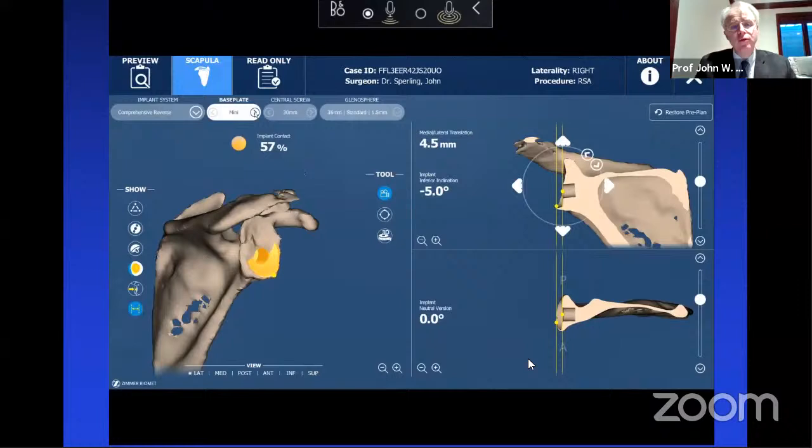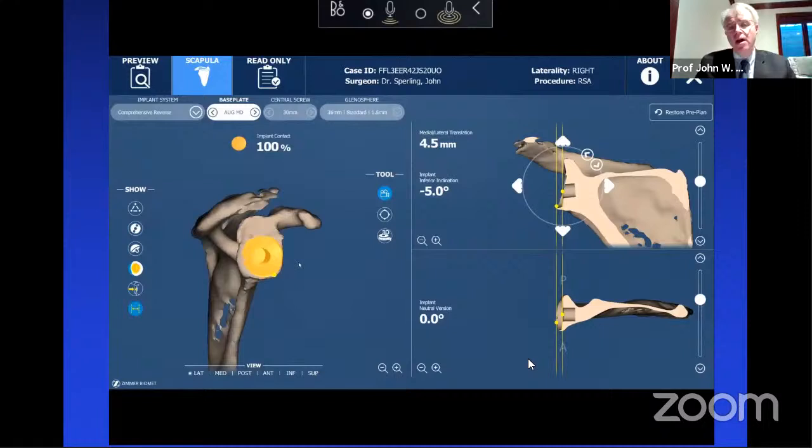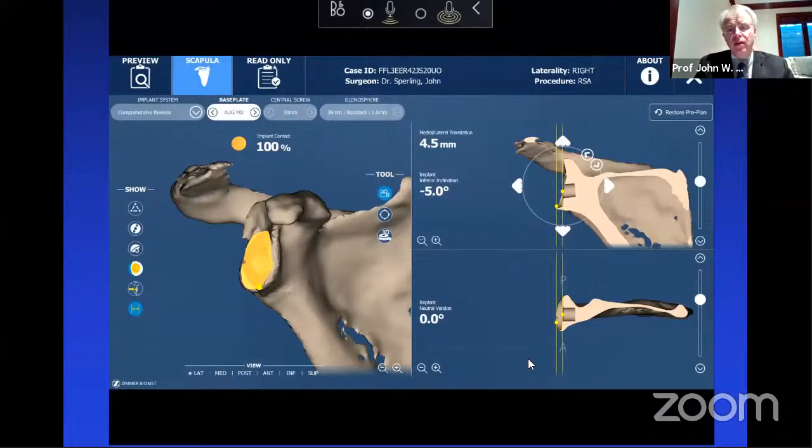So what we'll do now is to go ahead and switch from the mini. We'll look at a small augment, and you can see now we get some improved lateralization. And then what we'll do in this patient, we'll use a medium augment, and this will be able to get improved contact and improved lateralization. The other thing we'll do is to think about the glenosphere position. Again, I'll minimally dial the glenosphere down in these patients.